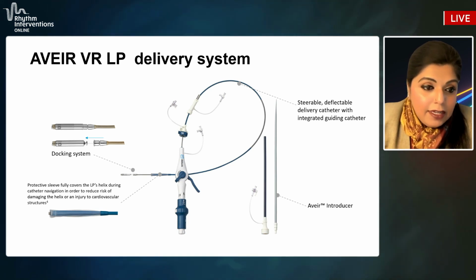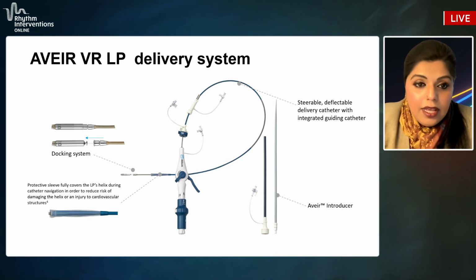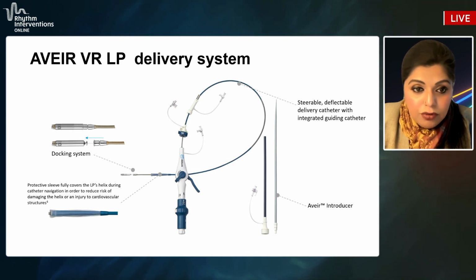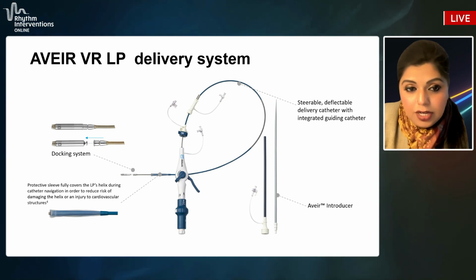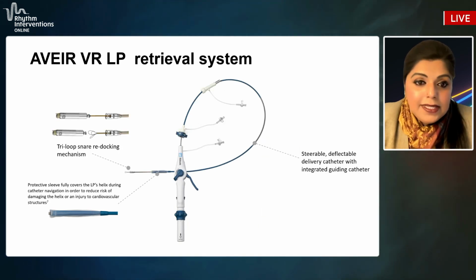There's a protective sleeve that comes over the helix to protect the helix and to protect the cardiac structures that can be moved forward. You can see there are 3 irrigation ports. They're all separately irrigated. This is the valve bypass tool. This is the protective sleeve through which the contrast is injected. And this is the irrigation port into the actual device and the tethers. So the contrast really does not touch the tethers and such. That's actually advantageous too. So that's the system as such.